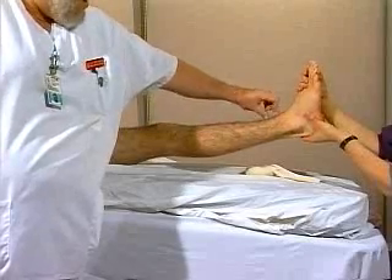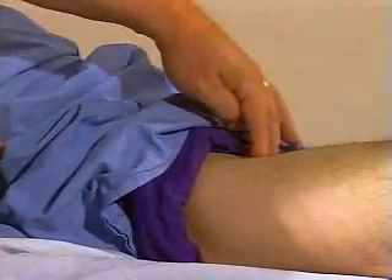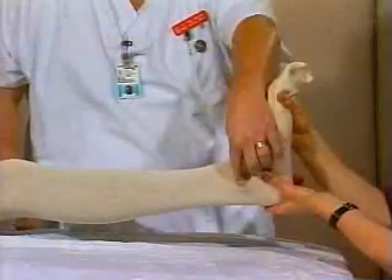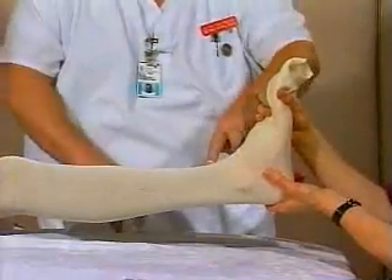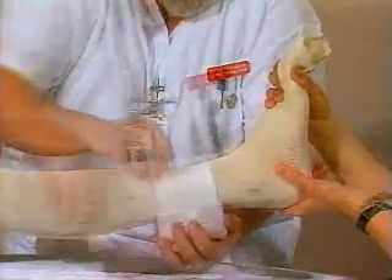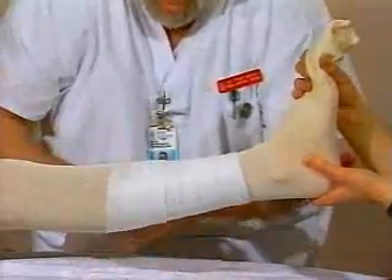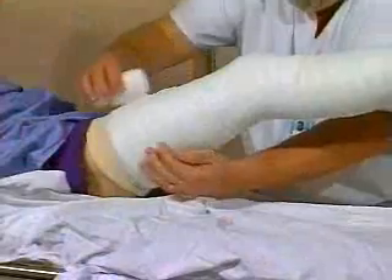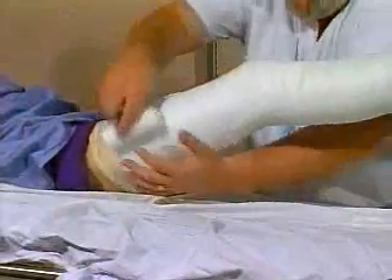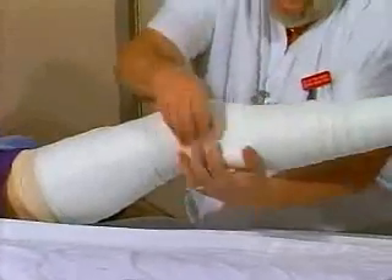A cylinder cast extends from about 5 centimeters proximal to the tip of the malleolus to the upper thigh. Start the cast padding distally with about 4 to 5 wraps at the lower end and extend proximally, finishing with 4 to 5 wraps at the upper thigh. Extra padding is required over the fibular head to protect the common peroneal nerve.